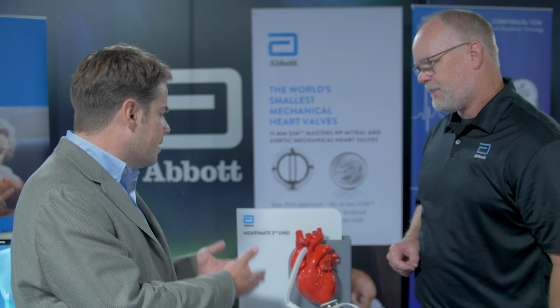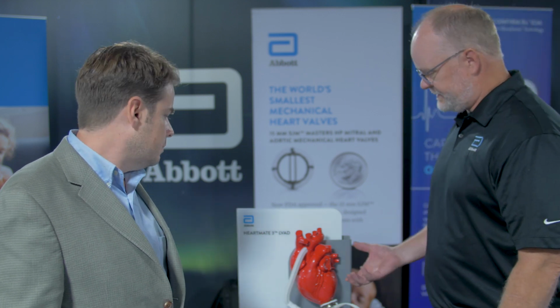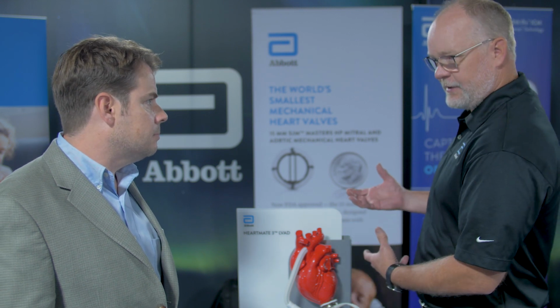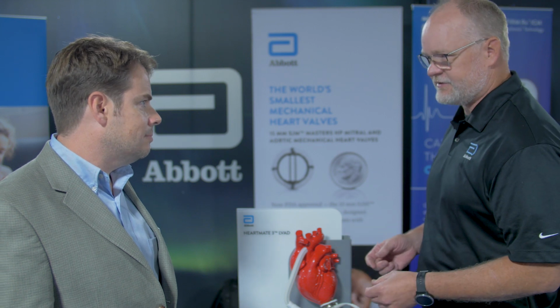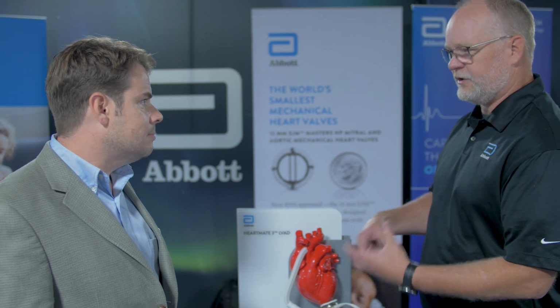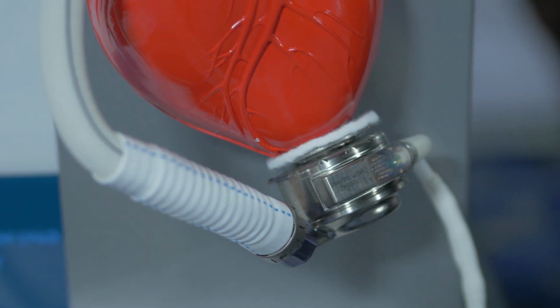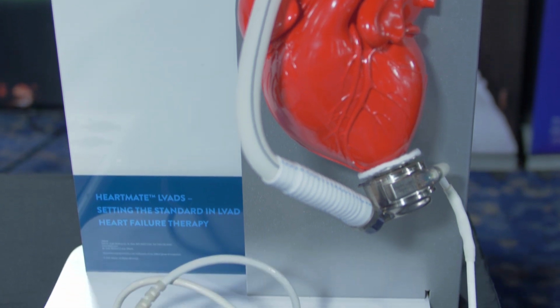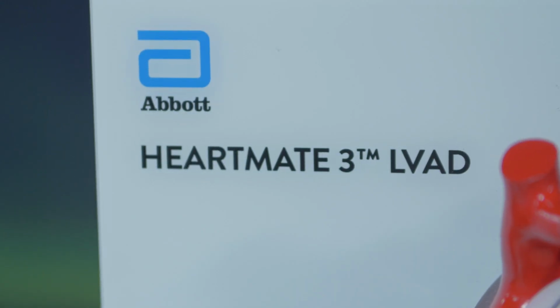You basically can't use blood as a lubricant because you've got to avoid clots. Yeah, exactly. Blood is wet, right? It's a lubricant to kind of help cool things. Most of this is all titanium pieces, so it's not really affected by the temperature, but you're actually moving blood with a titanium component. So having that suspended through magnets improves that and helps reduce and eliminate clotting. Yeah, absolutely.